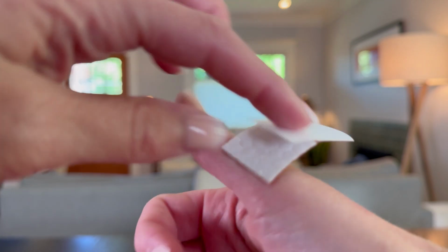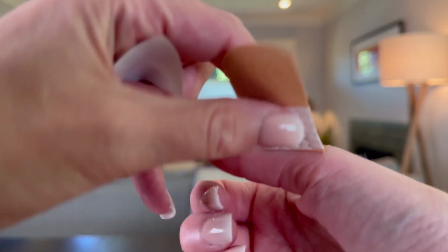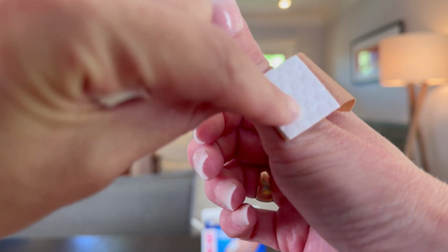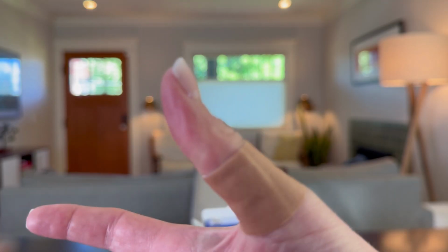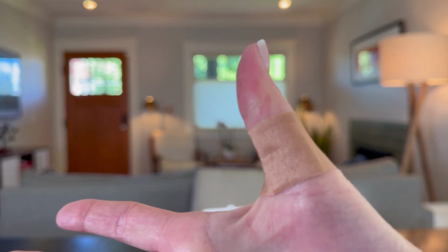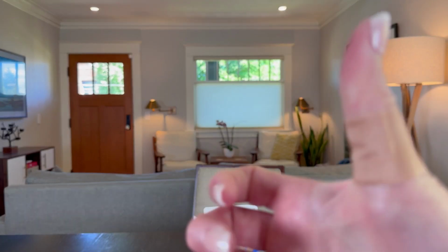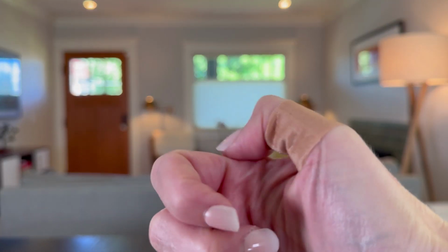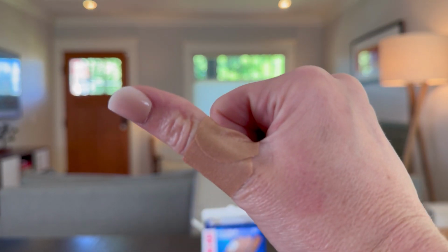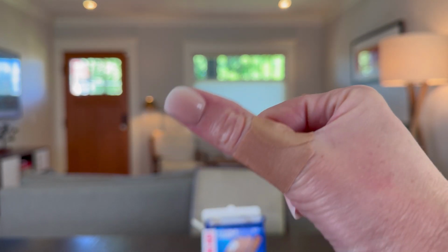Now these are their more standard bandages in that they don't have any adhesive around the sides of this main piece, so it can pop up along each of these edges, and that's fine by me. With most wounds, it's fine that they're breathable, and there are definitely options if you just want a bandage just for a knuckle or somewhere that bends, but these are just really, really nice Band-Aids all around.